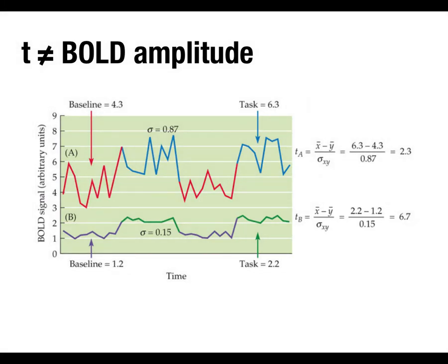And so where this becomes important is when you look at brain activation maps, typically they're statistical maps. So they're plotting as the color scale, like the t-values or the z-values, whatever statistical values. And you'll see some really bright areas, those are the biggest statistical values. That doesn't necessarily mean those areas showed the strongest activation. They showed the most statistically robust or statistically significant activation. But as you can see here, those might be relatively small signal changes, but also low noise. And that can happen because the noise across the brain is going to be different.